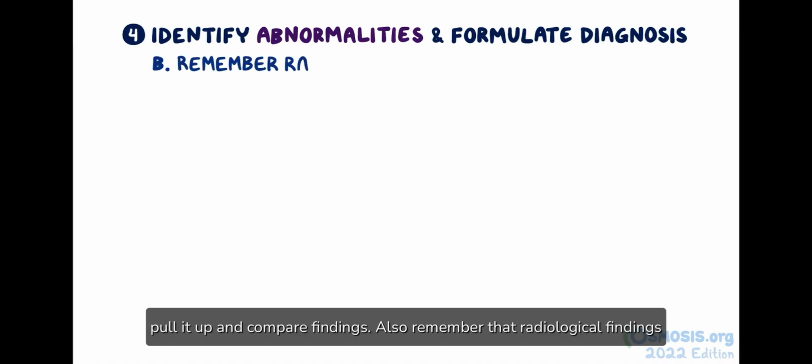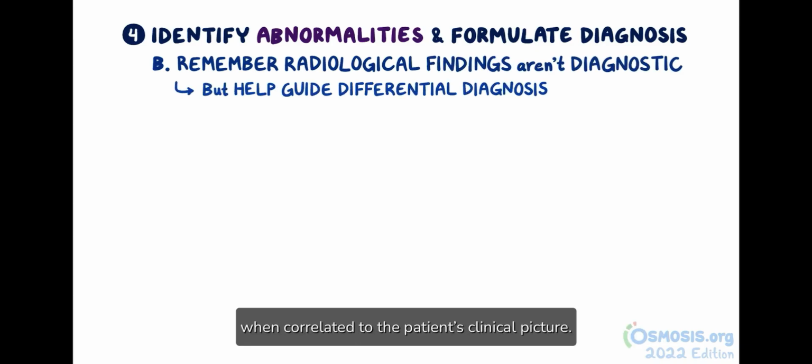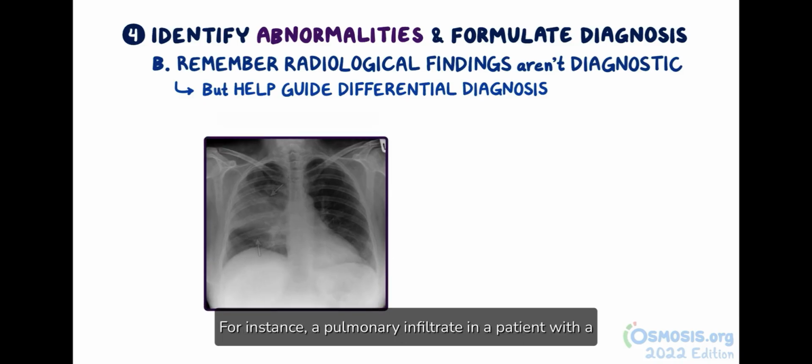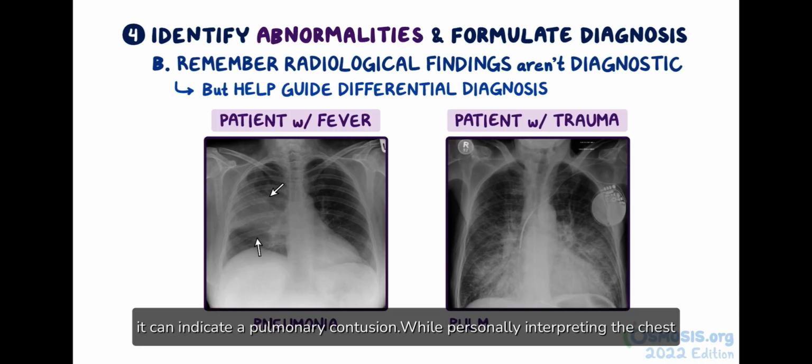Also, remember that radiological findings aren't diagnostic, but they can help guide a differential diagnosis when correlated to the patient's clinical picture. For instance, a pulmonary infiltrate in a patient with a fever can indicate pneumonia, while in a trauma case, it can indicate a pulmonary contusion.